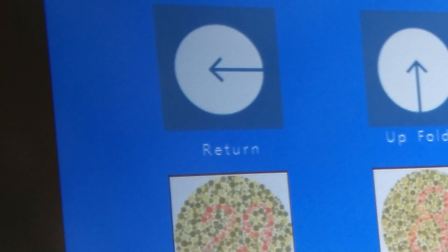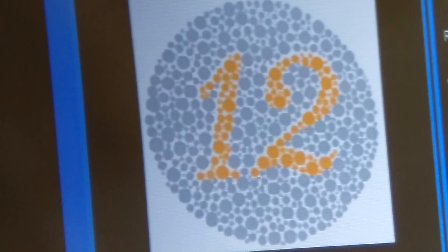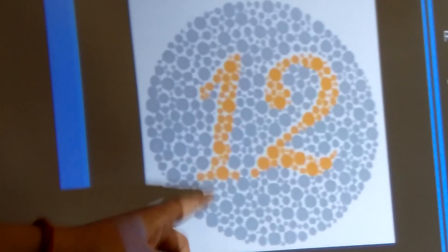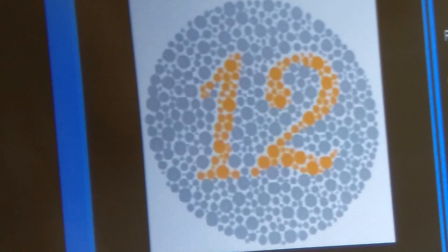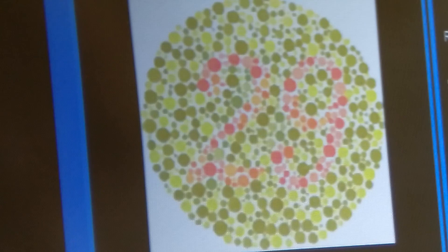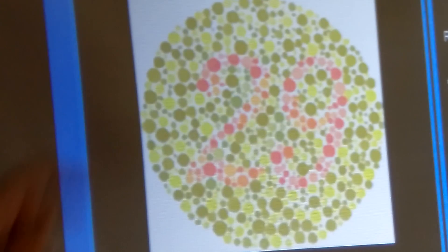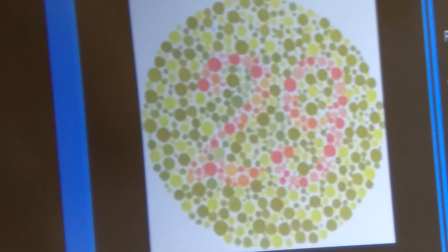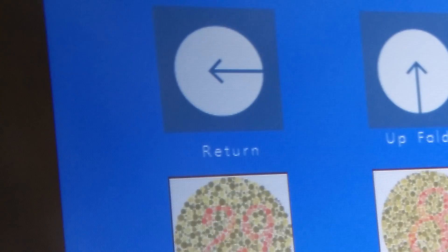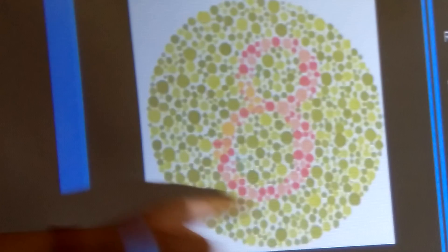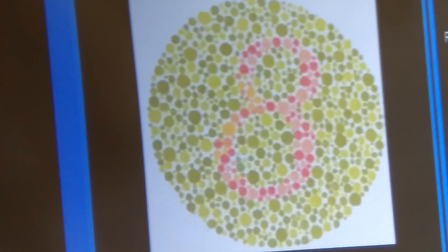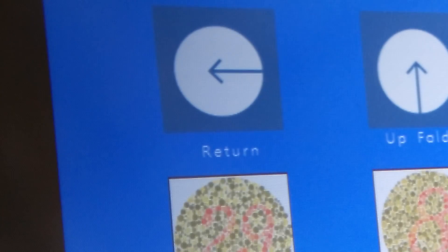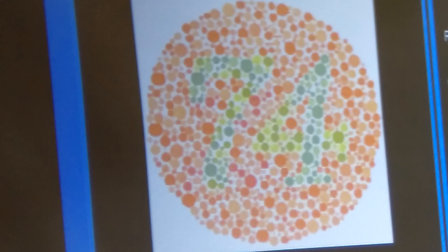The letter is 7. The number is 12. The number is 2, 9, 29. The number is 8. The number is 7, 4, 74.